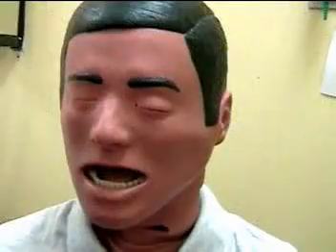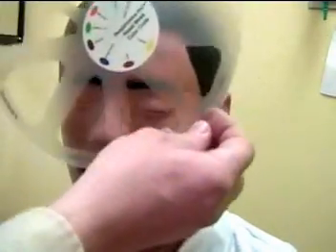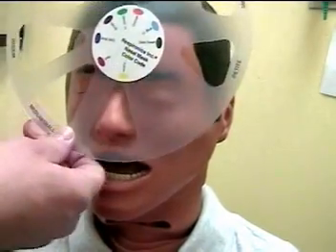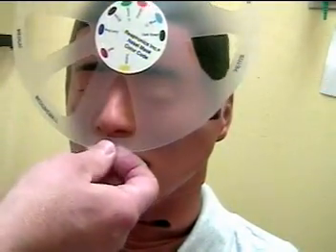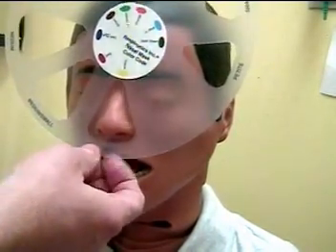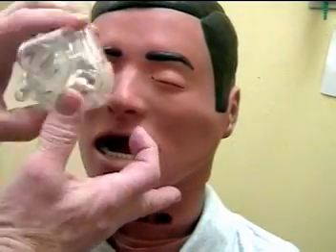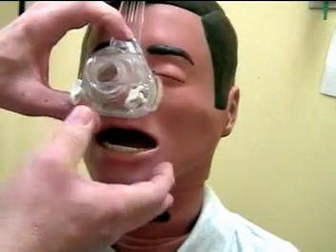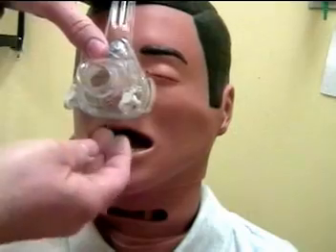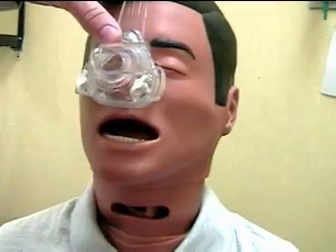Show you the mask fit wheel. As you fit the mask on, you try and identify the proper size that doesn't overlap the eyes or go too far on the mouth. So in this case, a small mask or a medium small would work best. And as we place the mask on the patient's face, we make sure that we don't overlap onto the eyes or go too far under the nose and go over into the mouth.